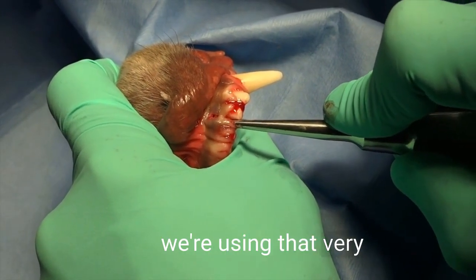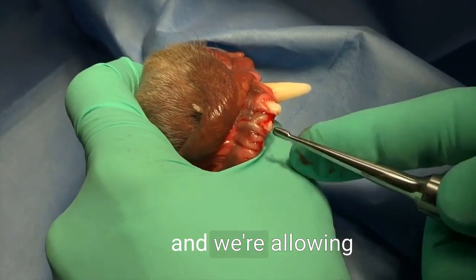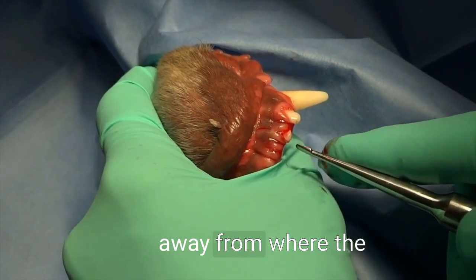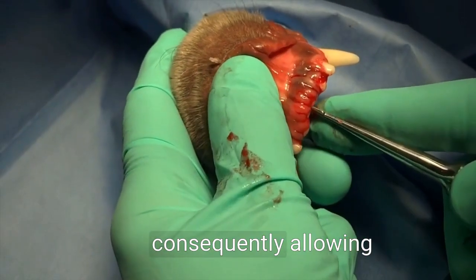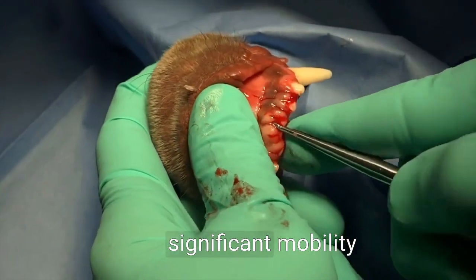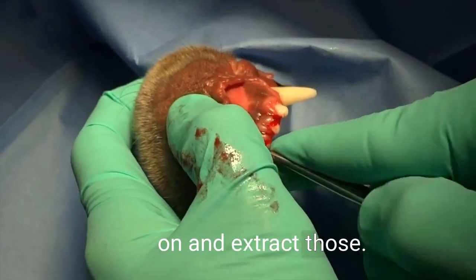We're using that very simple technique where we're applying force on a continual basis — not letting up — and allowing the bone to expand away from where the luxator is and into the other side, consequently allowing that tooth to attain significant mobility.